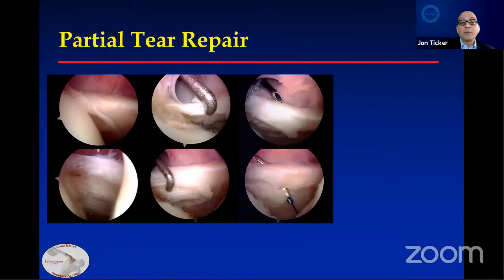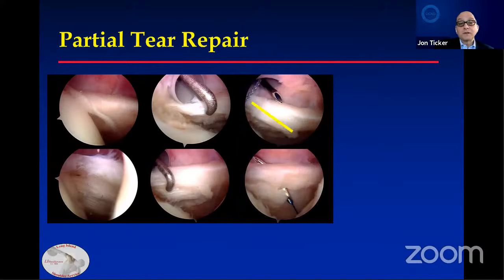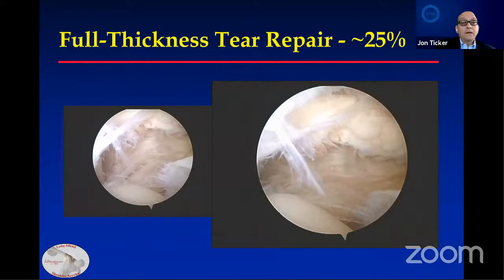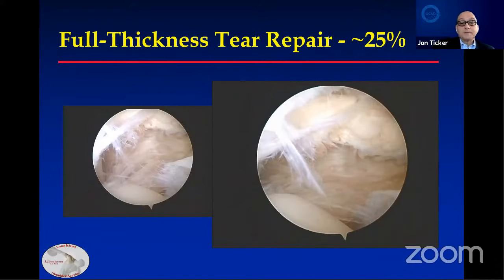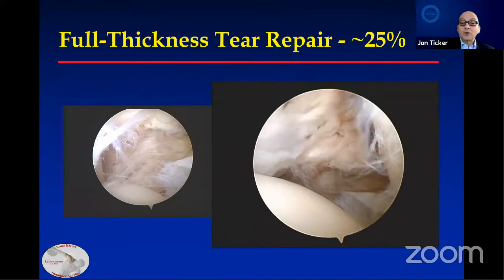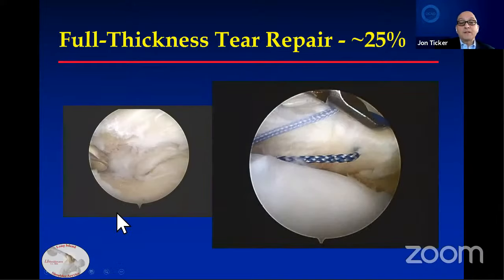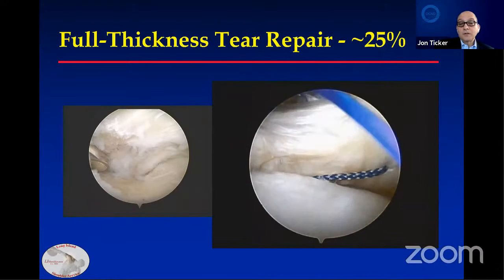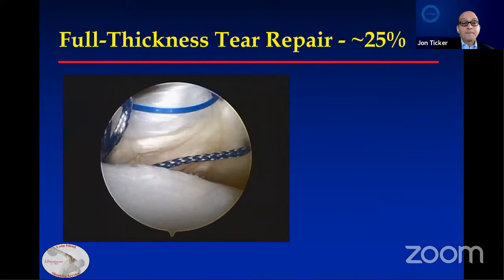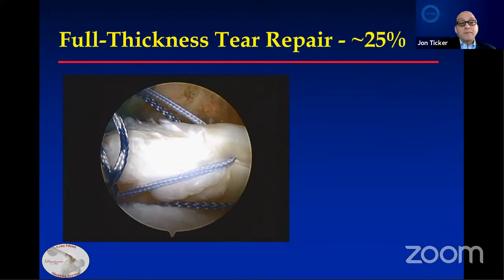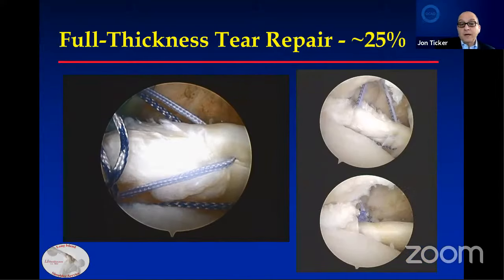It's thin, so for me this is one I'm going to want to repair. I'll use a similar device at this angle to pass through — I don't want to pass it in any other angle to get a nice secure repair. This is a full thickness tear repair, about 25%. In the left shoulder, you can see the humeral head below the anterior labrum. I want to expose the bone and then repair the tendon down to it — I've already inserted the anchor and I'm now going to shuttle my suture through the tendon, then tie them to bring the tendon back where I want it.